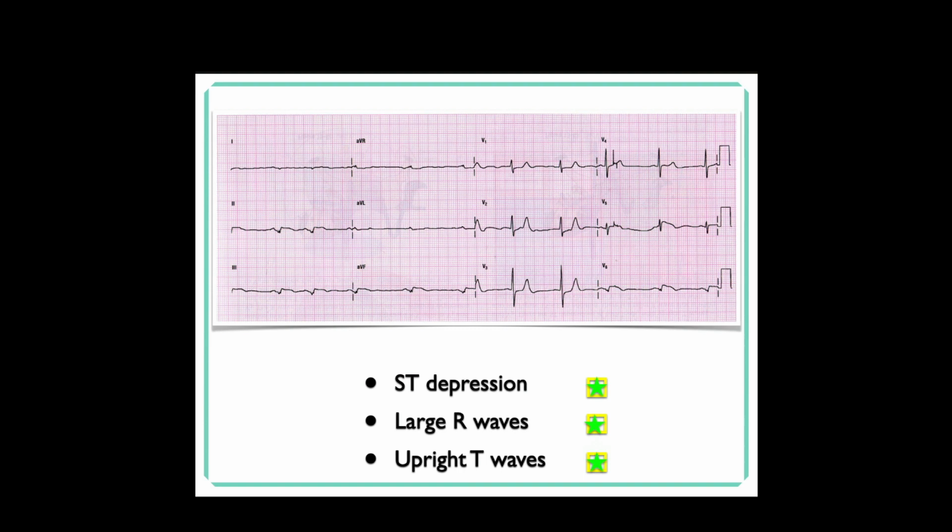It's either something between the electrode and the heart, so that can be obesity, it can be pericardial effusion, something that makes it difficult for the electrode to sense. The second would be if somebody was in really bad heart failure, so the impulse going out is just not very good. So one or the other.